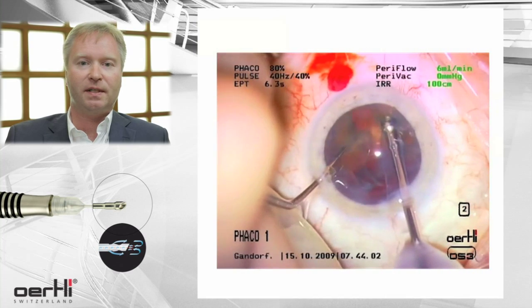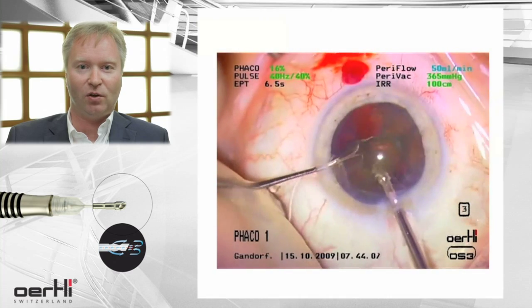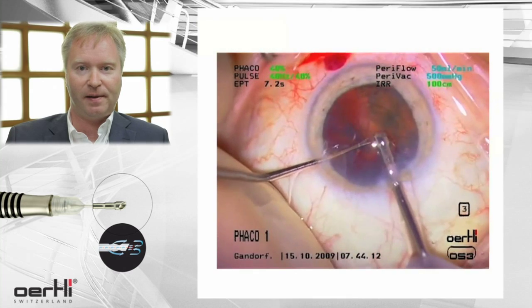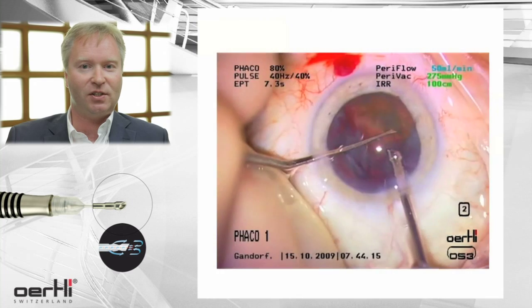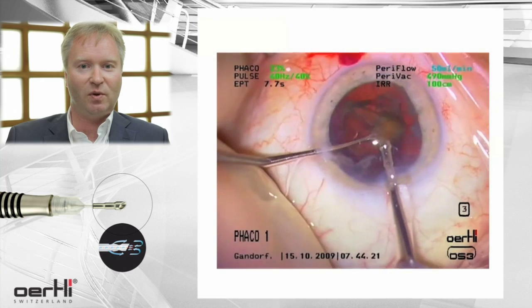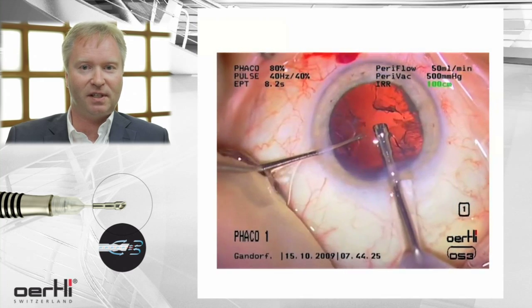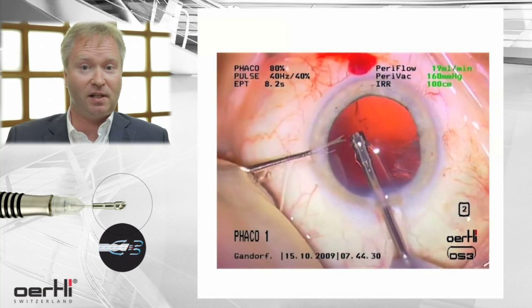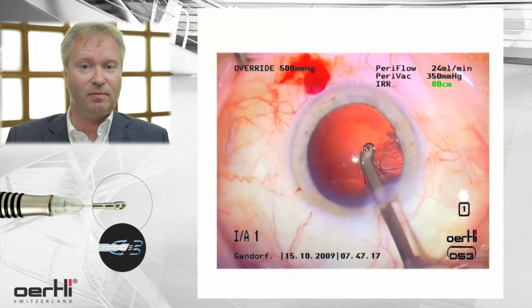On this video you can see how the fragments are magnetically held and locked to the tip of the EasyFACO tip. You can also see how the energy coupling is optimised there. The high followability creates a cone of fluid movement to the aspiration funnel, and then the energy coupling is perfect and the nuclear fragments are emulsified.